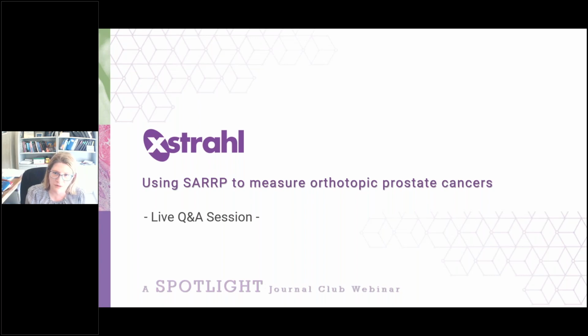We see absolutely no effect. Those tumors are not shrinking when we image these cells. We use this instrument also to irradiate our tumors and look at growth over time, and we do not see any inhibition of growth when we're doing the CT imaging. So I don't think that's a concern.